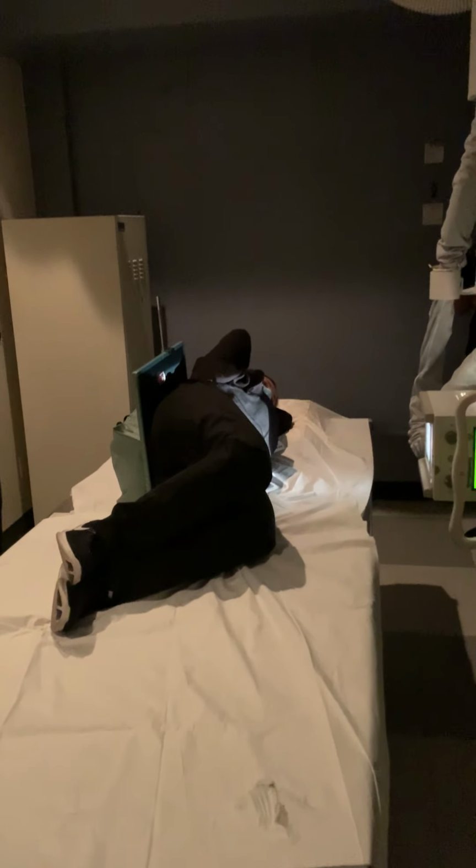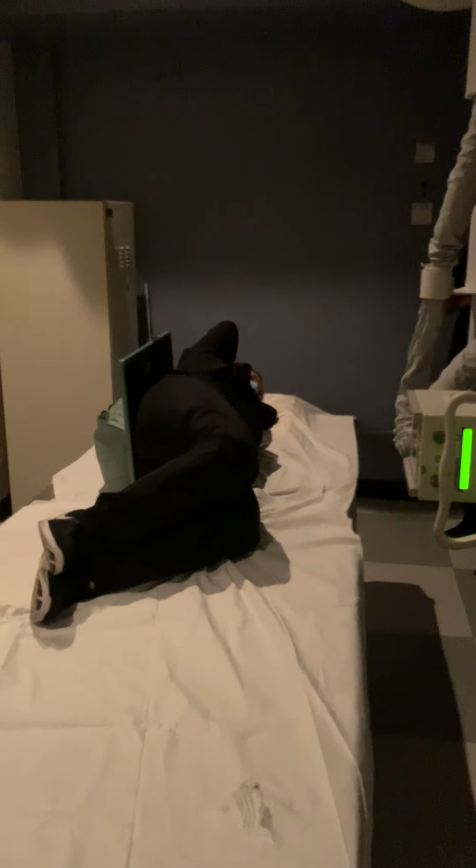Okay. Breathing instructions. Take a deep breath in. Blow it out. Hold it out. Don't breathe. X-ray. Breathe normally.